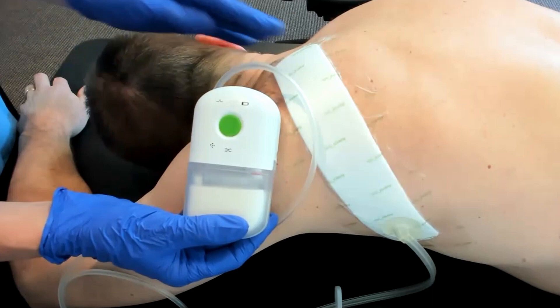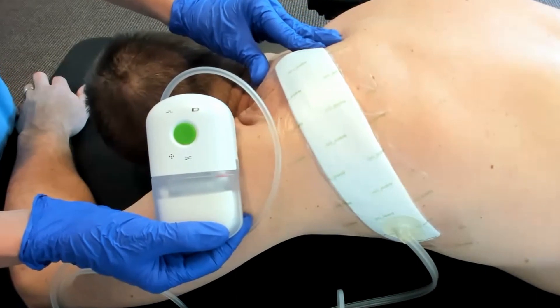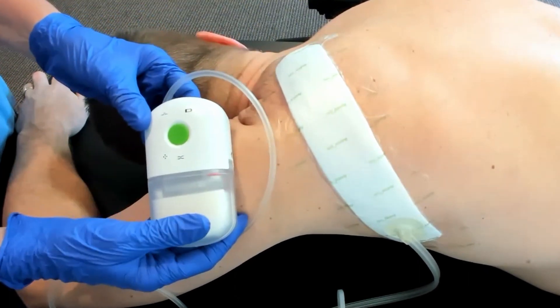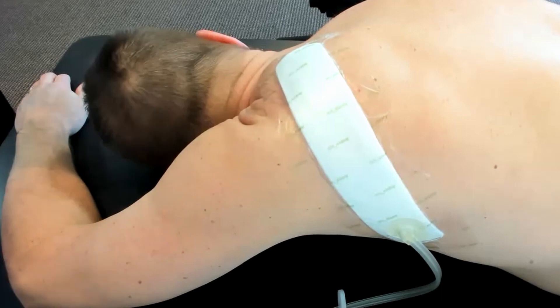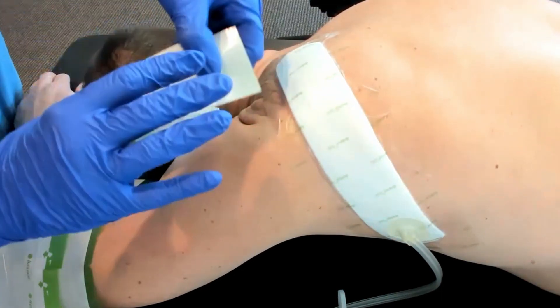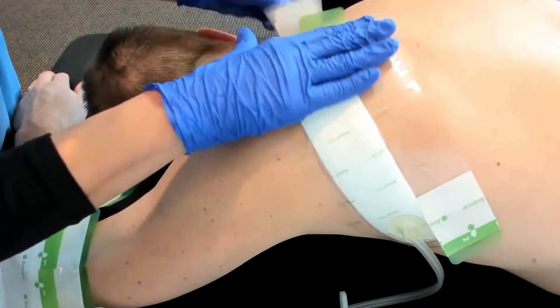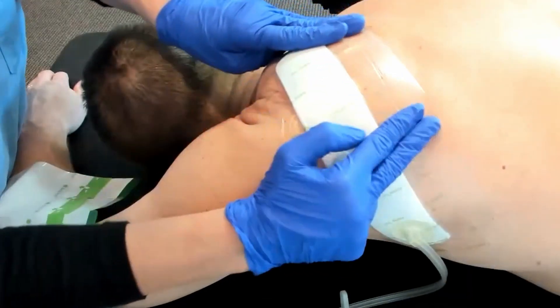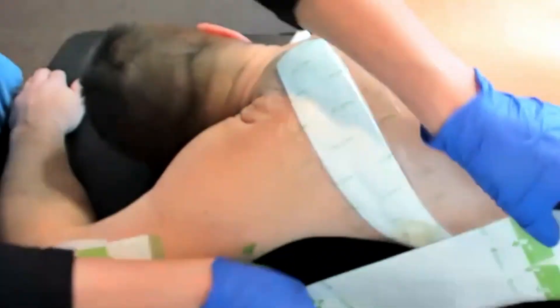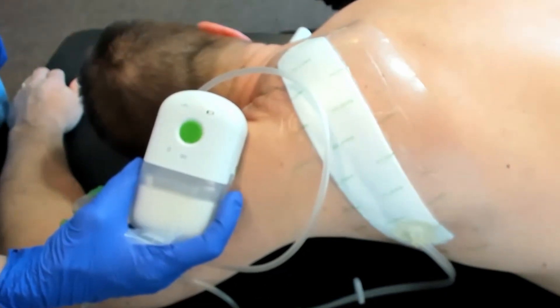Now this is fully deployed and you can see that it's nice and flat down to him — that's really all you need to do. But if you've got a little wrinkle, that's when you can take out the extra strips. They tear apart nicely and are all pre-made for you. Peel one on and you can add it all the way around — this really bolsters the dressing. If it's somewhere like the armpit, you'll probably want to add this extra layer of protection. You can trim these tape edges and go all the way around the dressing. It can stay in place for 14 days.